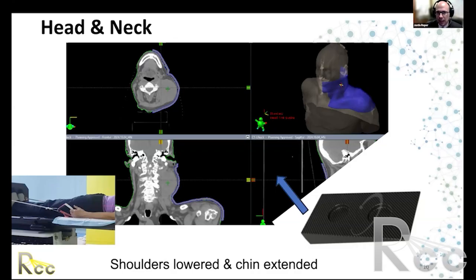The best way to minimize the air gap is to place the bolus directly on the skin surface and to then form the mask around it and to very intentionally place hands over that part of the mask as it cures in order to have a very snug fit such that the bolus is in good contact with the skin surface, and further such that the mask has an outline or an edge which encompasses the bolus so that essentially the bolus is built into the mask, so that when the patient comes back, that bolus is embedded and then it is positioned very snugly onto the skin surface.